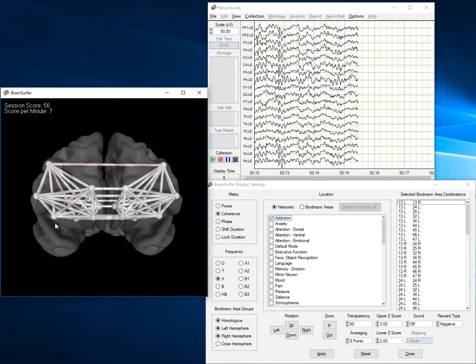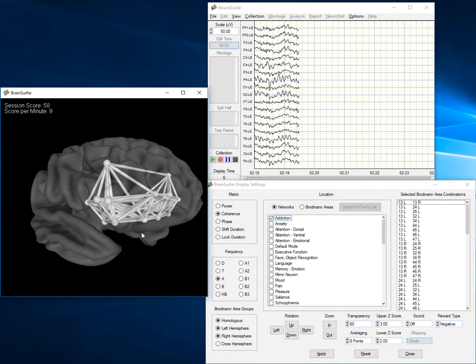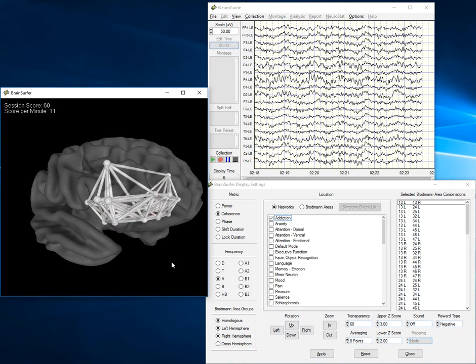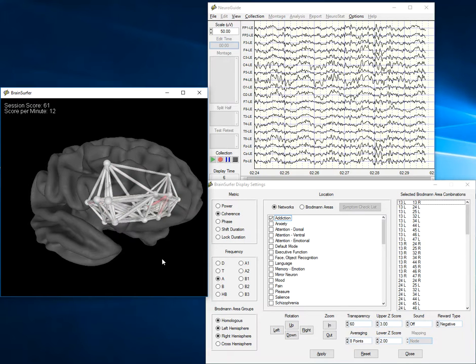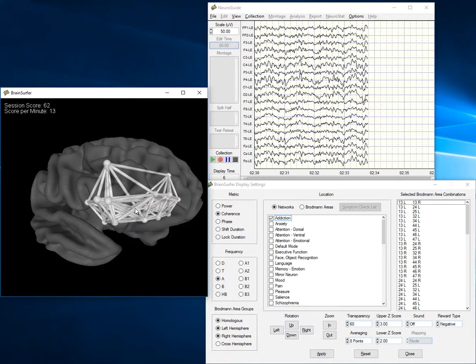drug rehabilitation program. And this is used in drug rehabilitation programs to help treat substance abuse patients and move them towards a healthy state in which the self-organization of the brain is occurring in dysregulated nodes and networks.